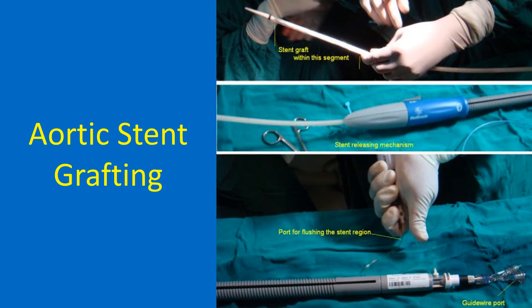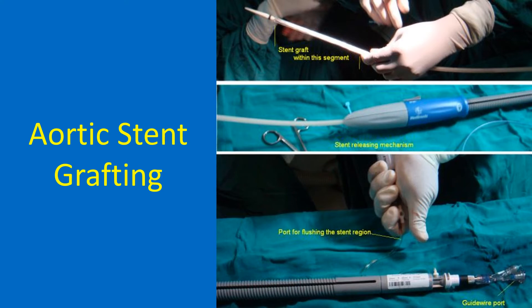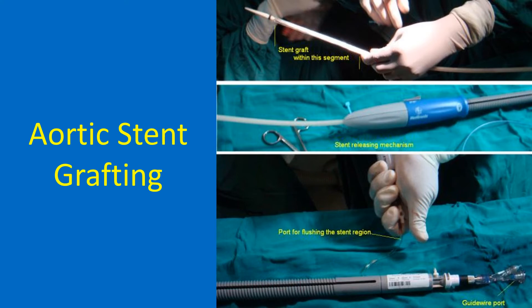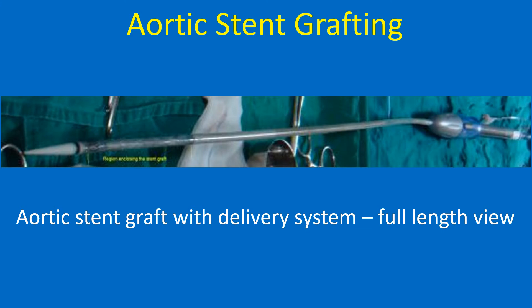The proximal end of the device has a mechanism for releasing the stent after accurate positioning. There is also a side port for flushing the stent region. The stent graft is mounted at the distal end of the device, and a guide wire port can also be seen at the proximal end.